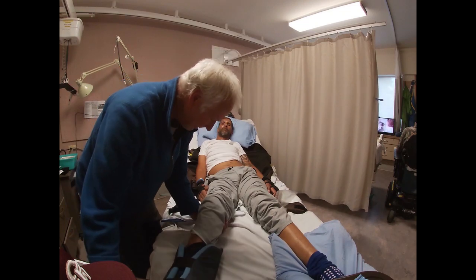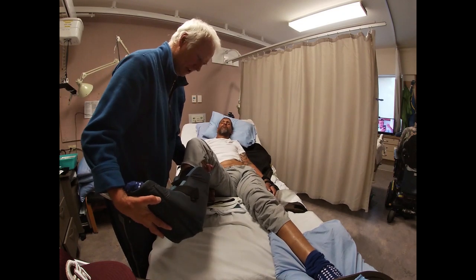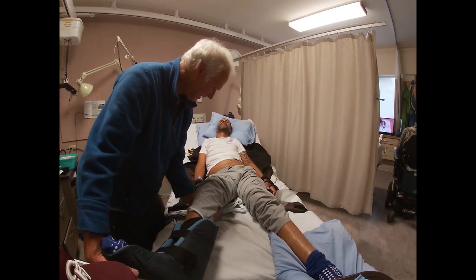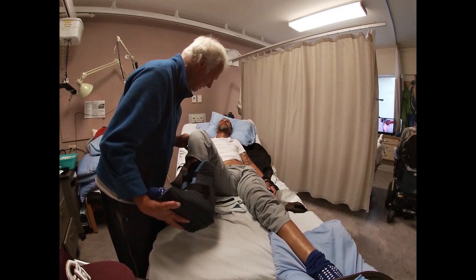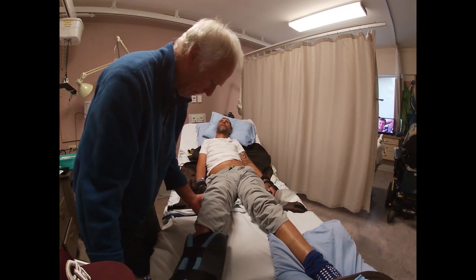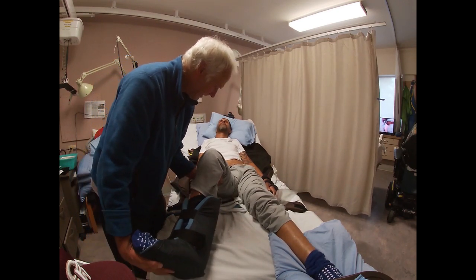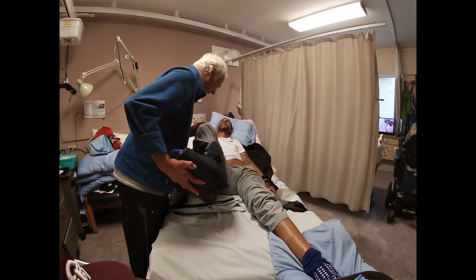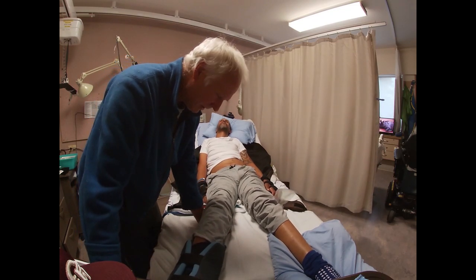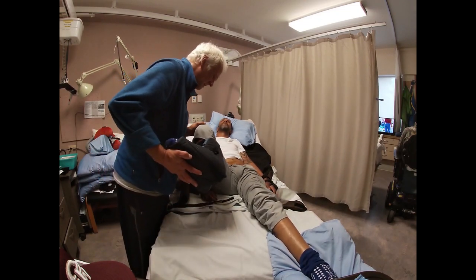You say, all right, in your mind, bring the knee up into flexion, and then back down again. Push down, push down. Okay, and then in your mind, bring the knee back up again. Bend the knee, bend the knee, and push down. Push, push. Okay, and up again. Bend the knee up. Bend the leg. That's it. And push down. Okay, in your mind, bend the knee up. Bend the knee. Good, good, good. And down.